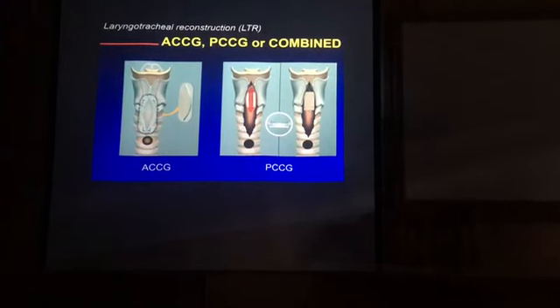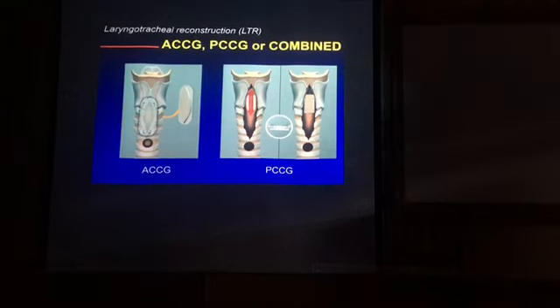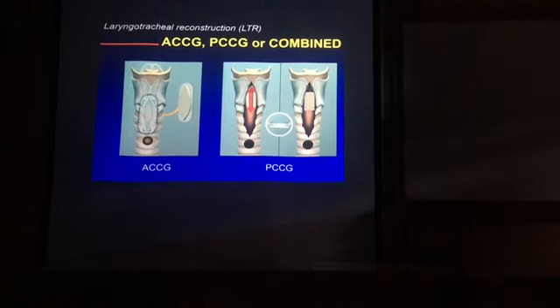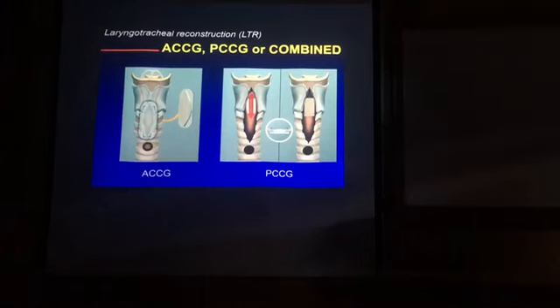For your laryngofissure, you use a mosquito and you open the mosquito towards the vocal cord, so you spread the vocal cord. Instead of having vocal cords like this, you try to make them like this because you have spread the anterior commissure with the opening of your mosquito. So the gesture is to go in, lift up, and spread.